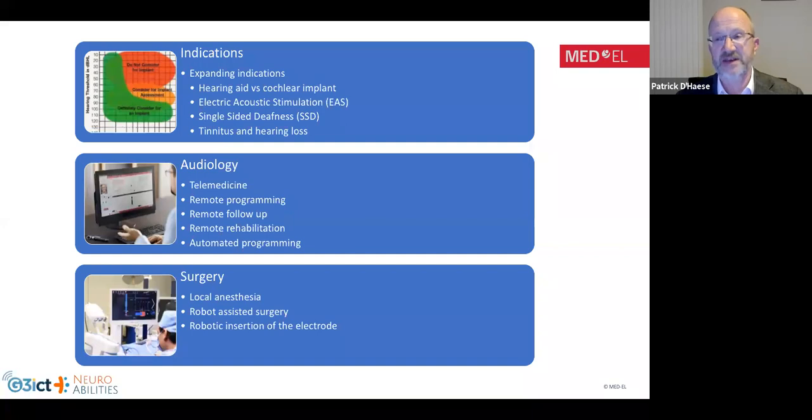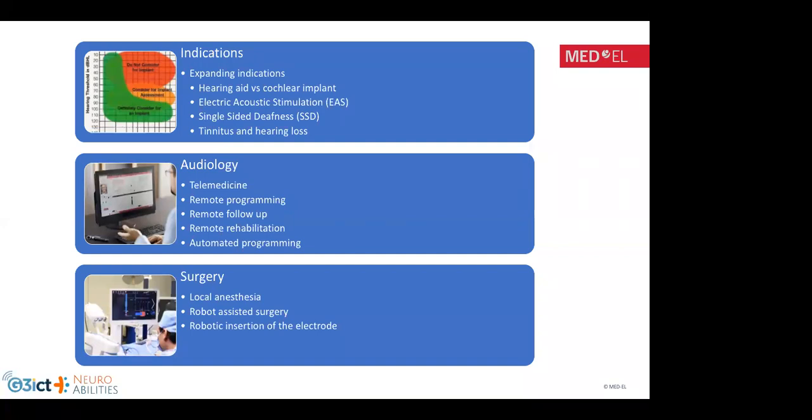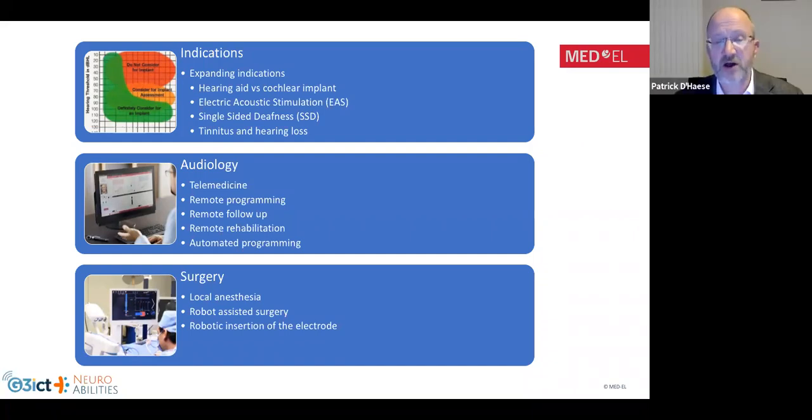And by the fact that less drilling will be required in the skull, recovery time will be shorter. And then finally, one of the bigger innovations coming is what is called the robotic insertion of the electrode. As said, a big thing is that you might cause inflammation within the cochlea, within the hearing organ, when you insert it.